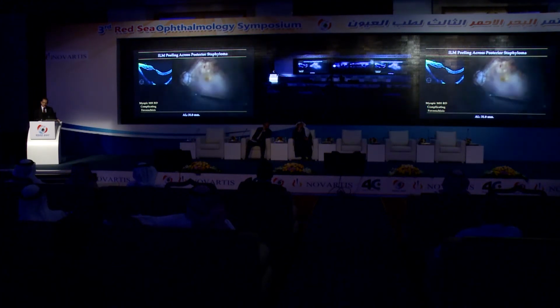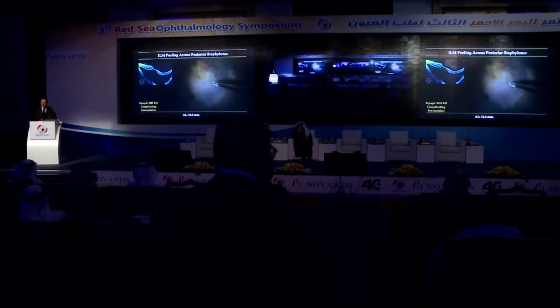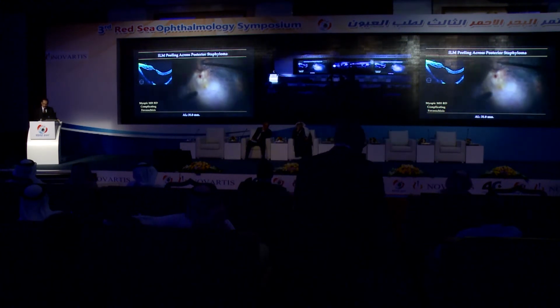The peeling should be directed toward the macular hole, and no traction should be exerted over the macular hole. Otherwise, there is enlargement of the macular hole and creation of many breaks. The peeling should be continued till the edge of the staphyloma if you would like to remove the rigid internal limiting membrane completely and relieve the traction exerted by the structure.